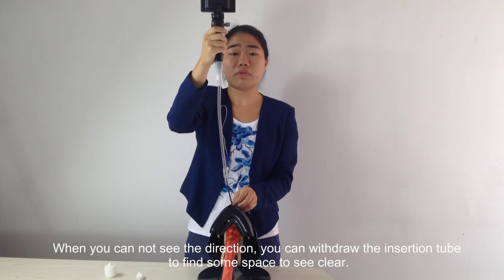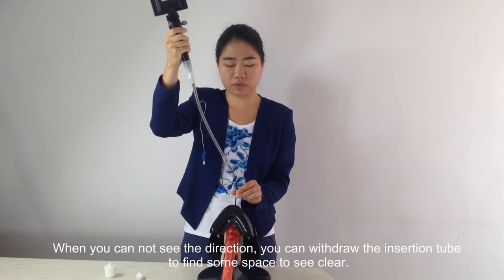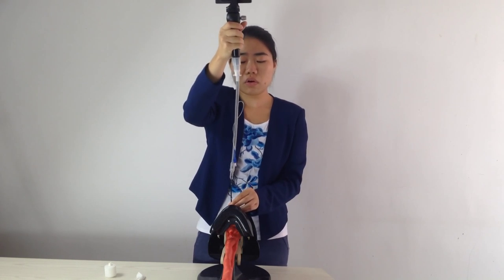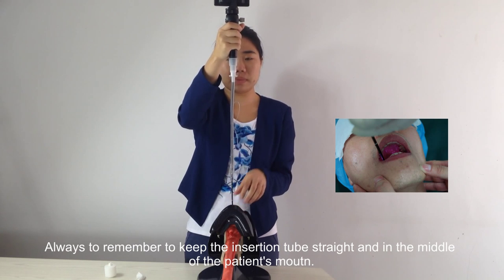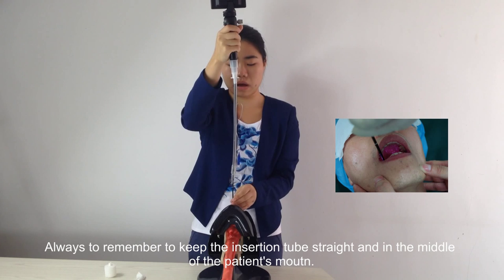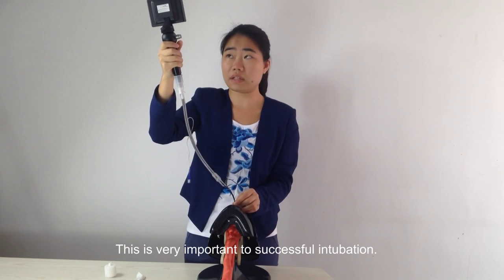When you cannot see the direction, you can withdraw the insertion tube to find more space and see clearly. Always remember to keep the insertion tube straight and in the middle of the patient's mouth — this is very important to successful intubation.